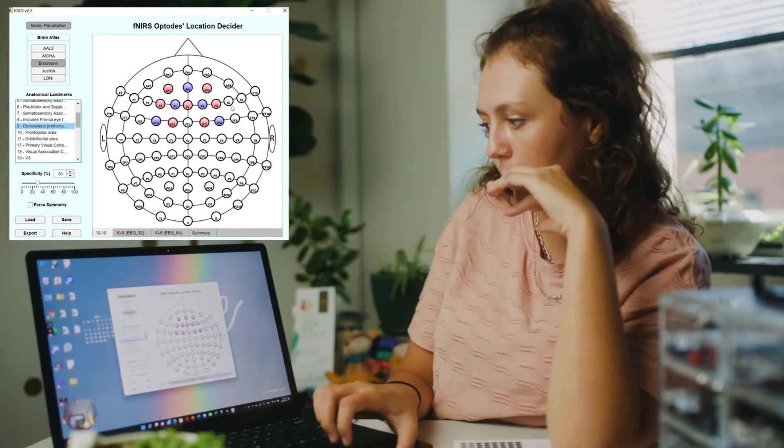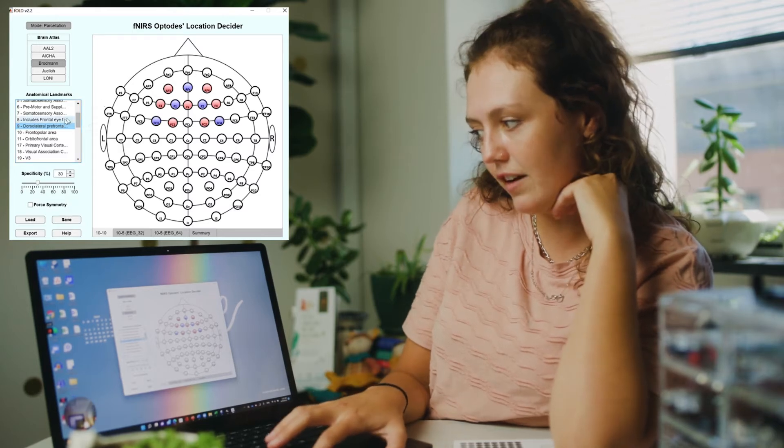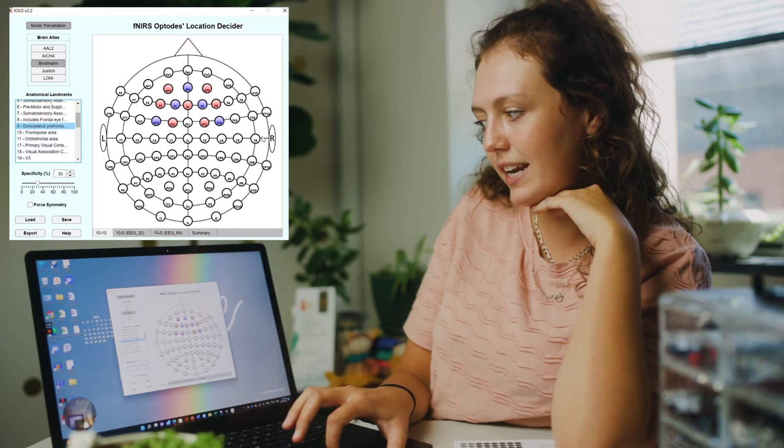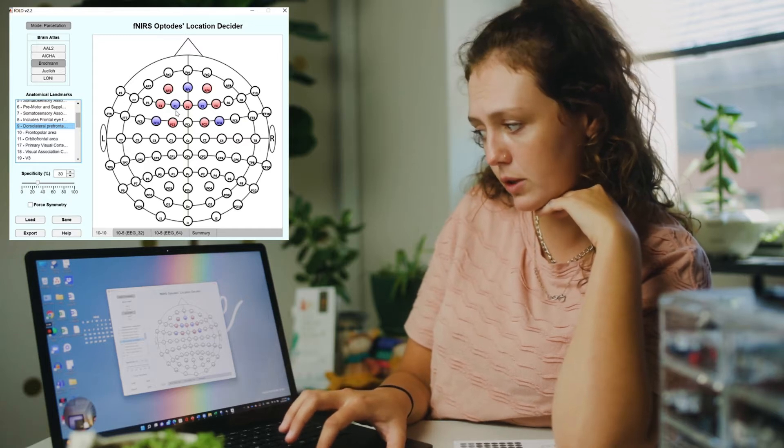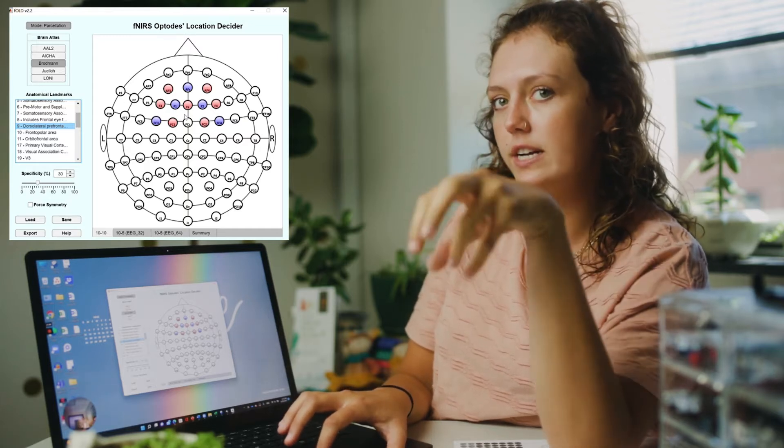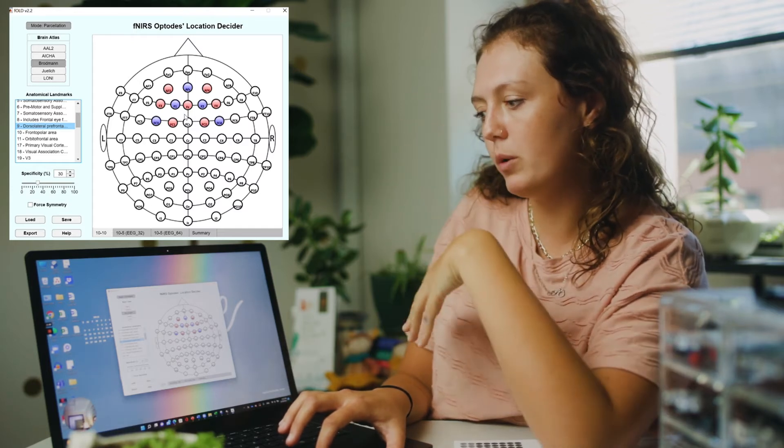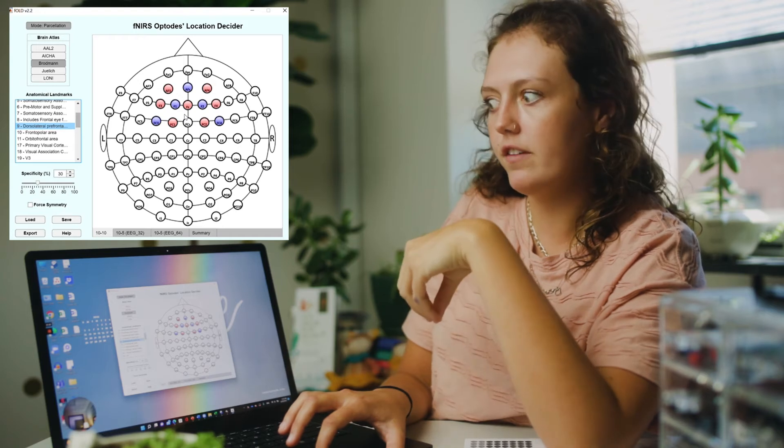As you can see, with my first click of the dorsolateral prefrontal cortex, it populated some optodes, some sources and detectors, to give you an idea what optode arrangement would be needed to cover the area of interest.